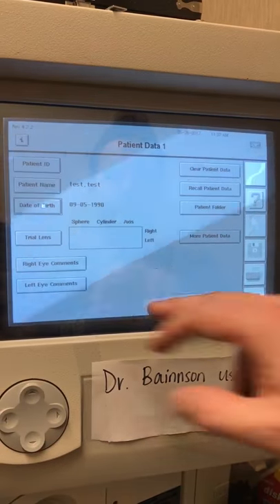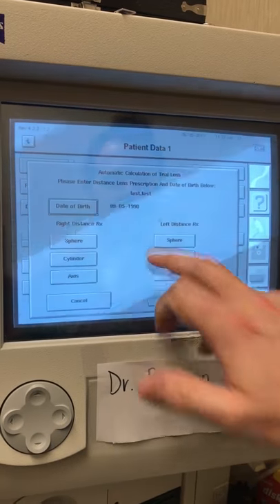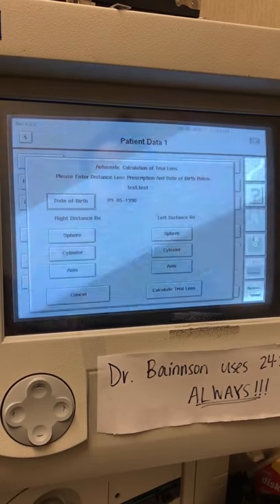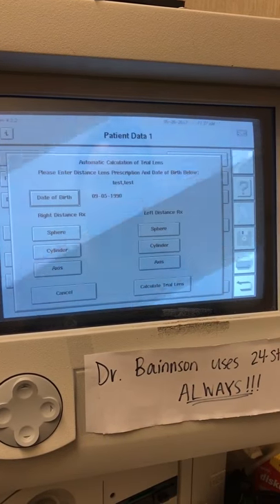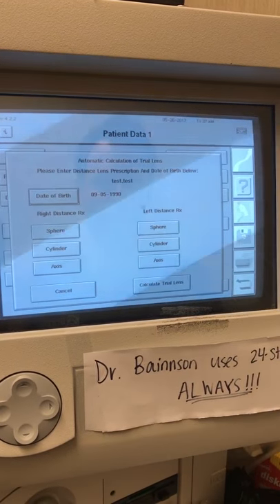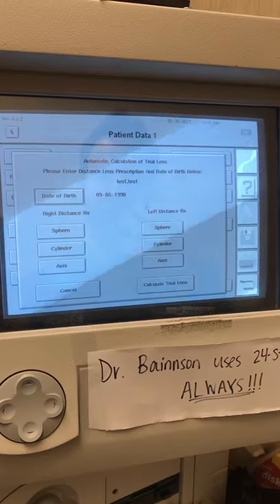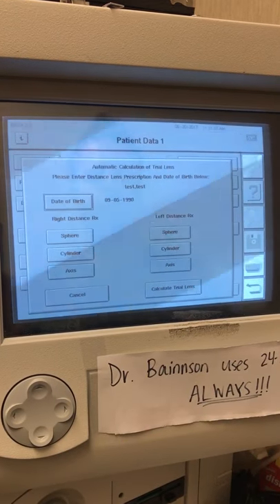And their trial lens. We're going to enter their distance prescription, and it'll automatically tell us what lenses to use for their reading vision, since we'll be looking at these lights in the machine that are close up.